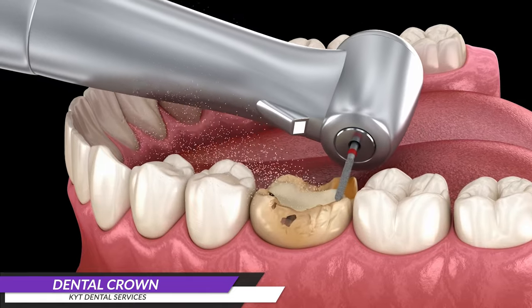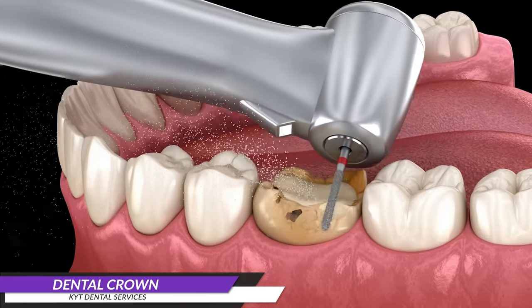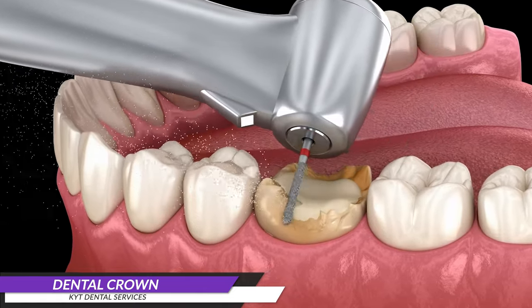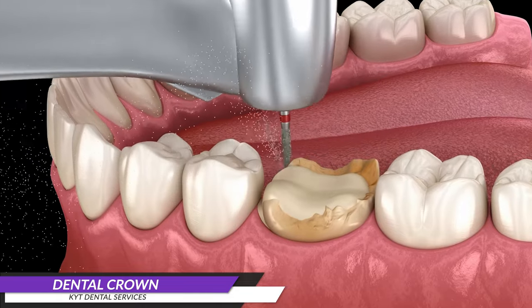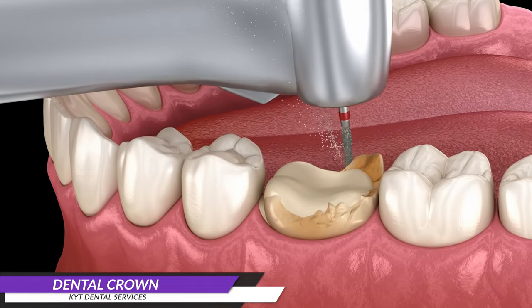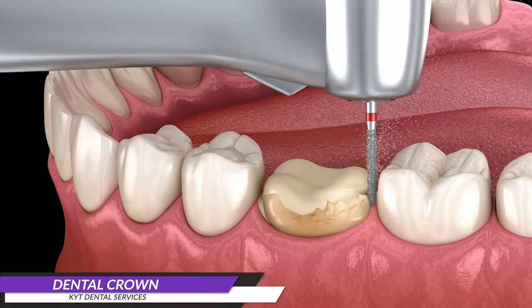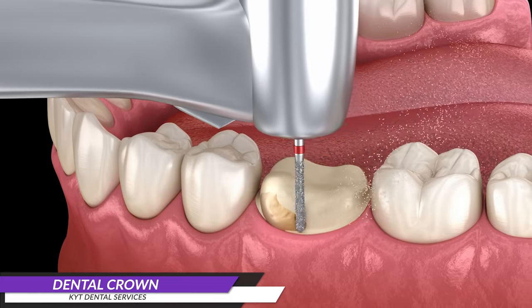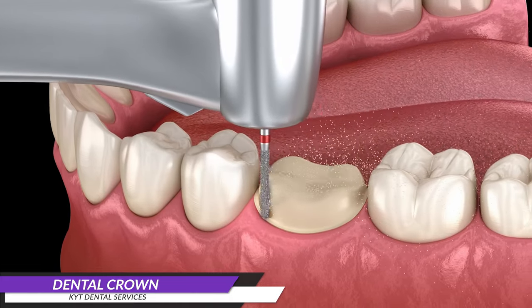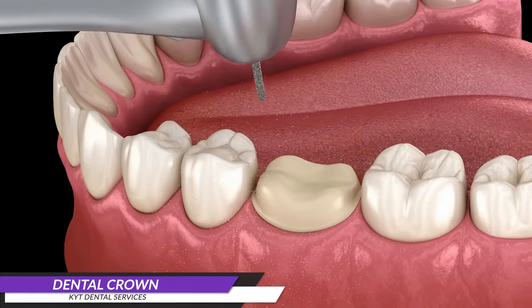Before shaping the tooth for a crown, it is essential to remove all cavities, decalcification, and tartar, ensuring a clean and healthy foundation. To ensure the fabrication of a precise crown, the dentist must shape the tooth perfectly before taking the impression to send to the lab.